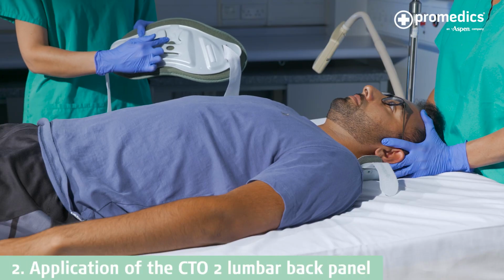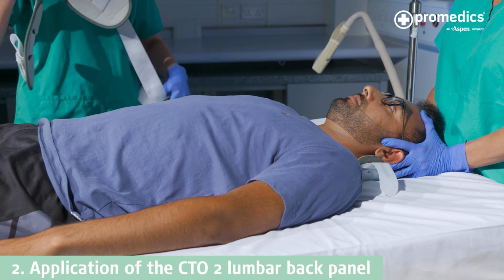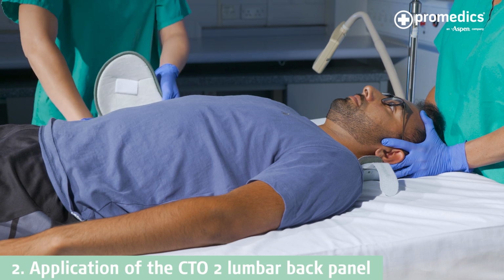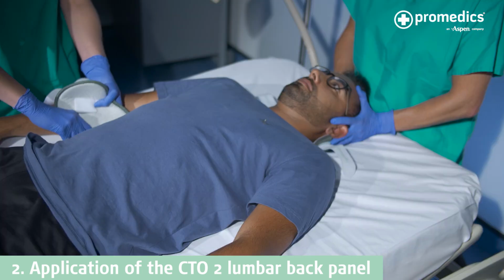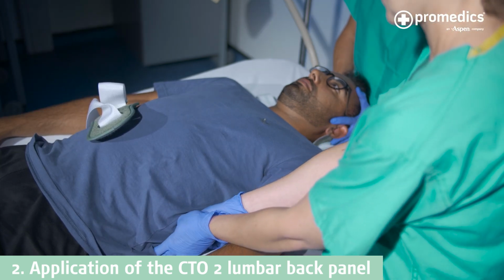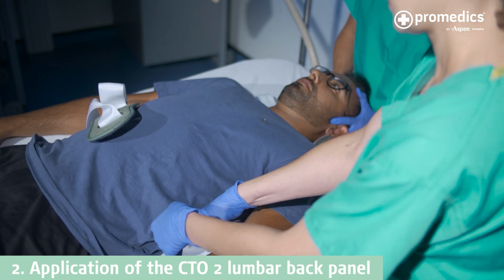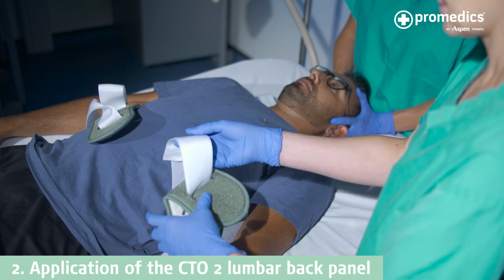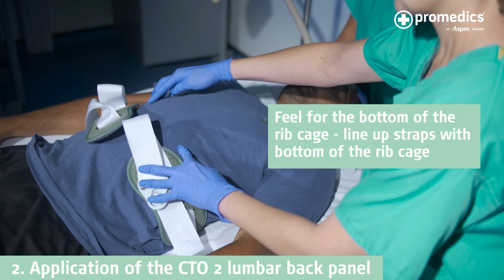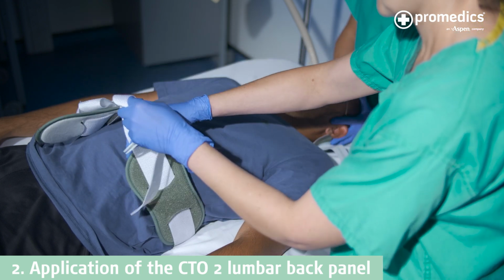To apply the back panel, position the panel next to the patient in line with the lumbar spine, ensuring the panel is the correct way round with the opening for the posterior strut facing the top, as shown. Pads facing upwards, slide the panel under the patient, then move to the opposite side and pull out the straps. Feel for the bottom of the rib cage and line up the straps with the bottom of the rib cage.